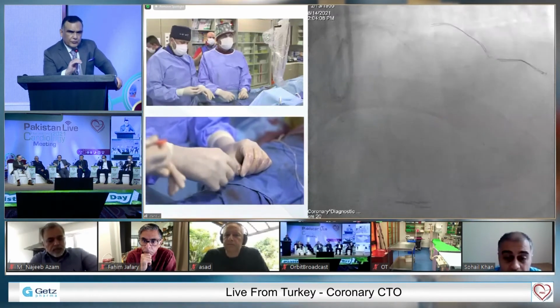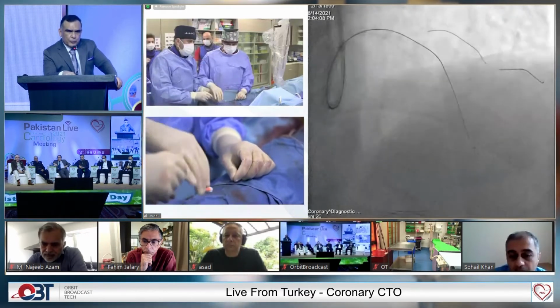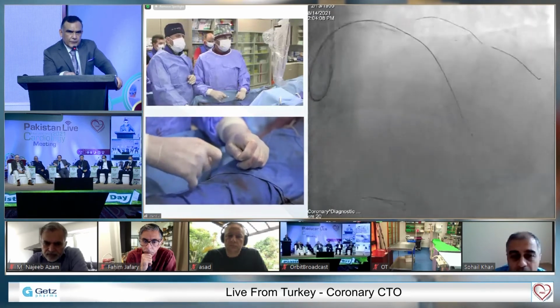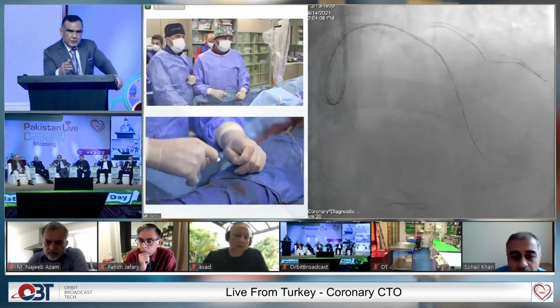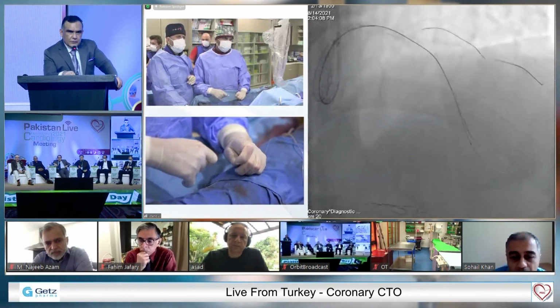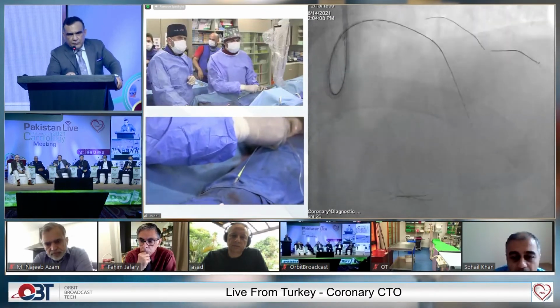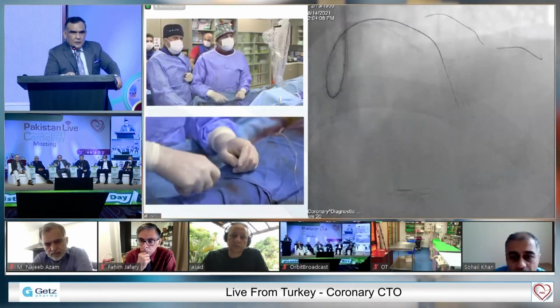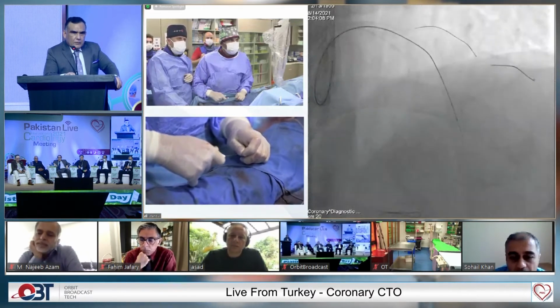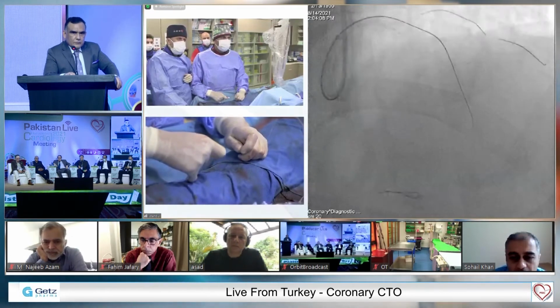So Omar, what's the harm if you already want penetration, in going for a Conquest Pro 12 or something like that with a hard tip? What's the aim, you mean? Why not use a Conquest Pro 12? I think, yeah, for the penetration, because that will have the most penetration among the wires. Yes, for the distal, I like the Gaia series much better than Conquest to puncture distal, more helpful to me. Okay.